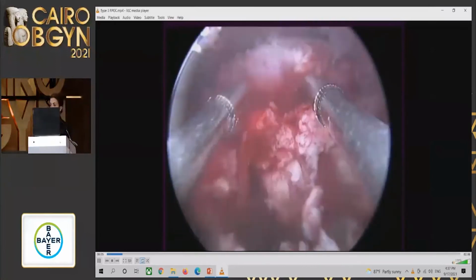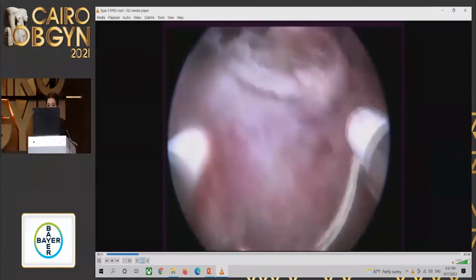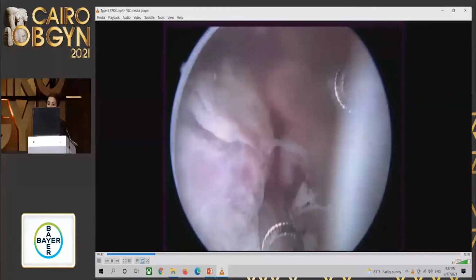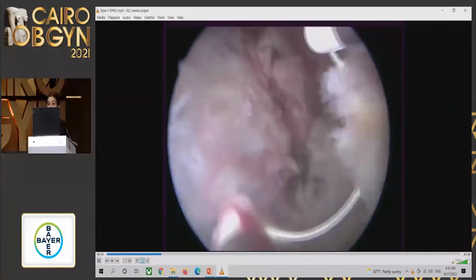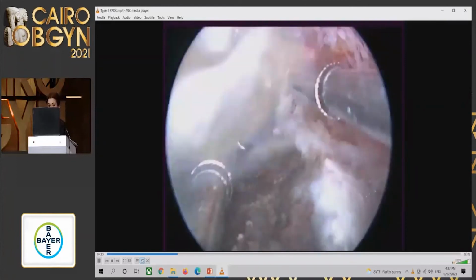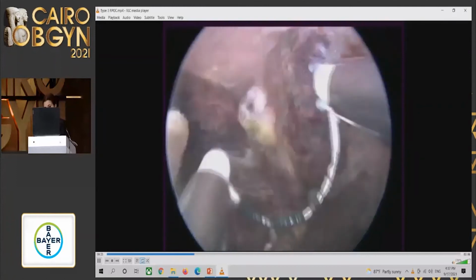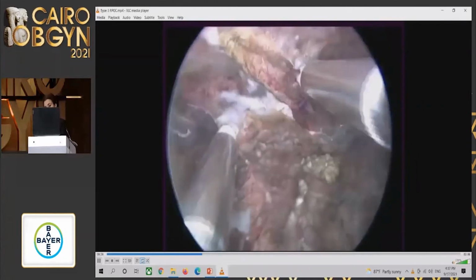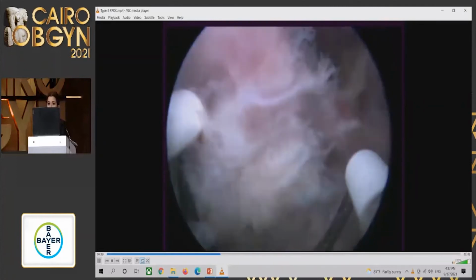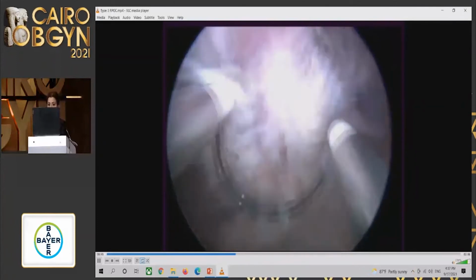Okay, in this case, it's interesting to see that also with hysteroscopy we can have some problems, especially when we don't know the vascularization beforehand. This is a case of an adherent lesion, and we can see how we remove the portion that is intrauterine. We can see the hyaline modification of the tissue. When we go near the myometrium, the cleavage is not possible to see clearly.